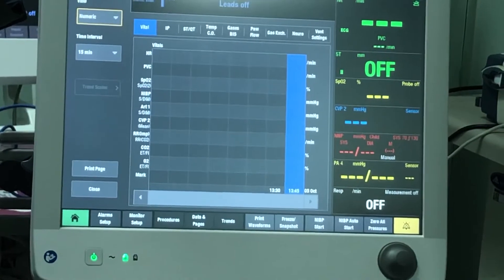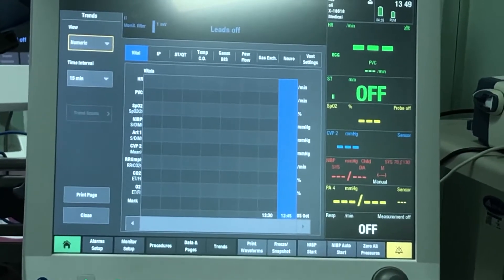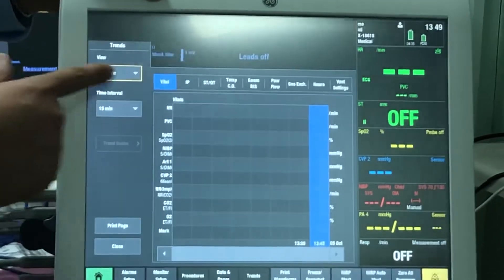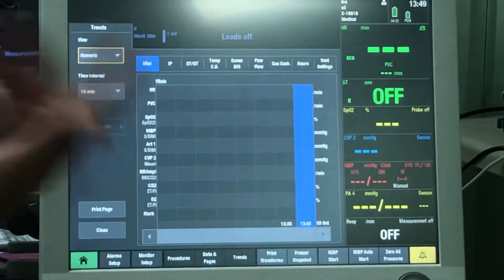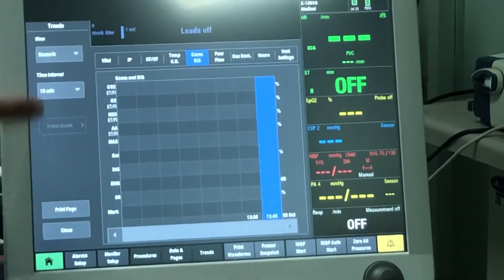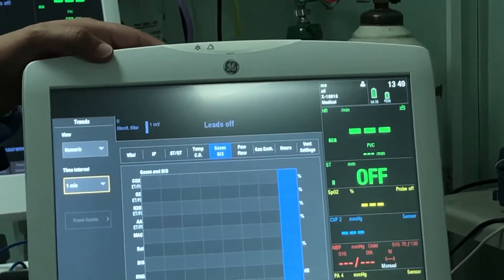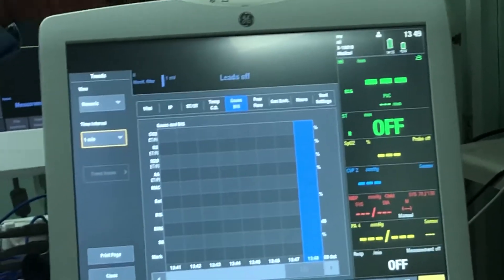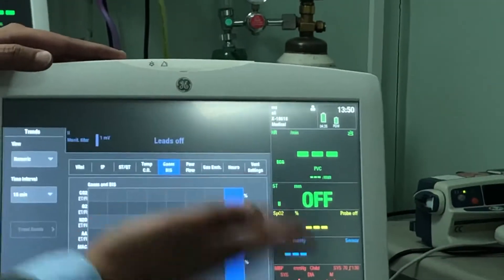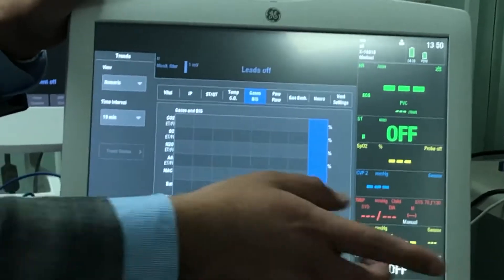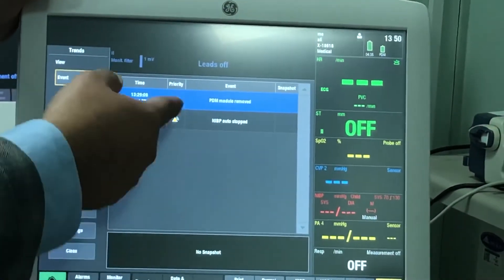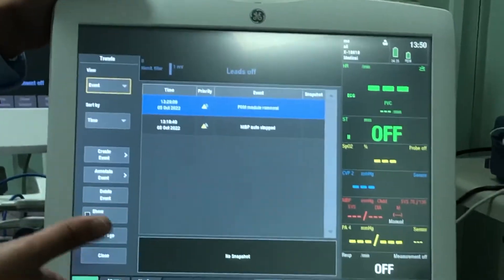For trends, all patient information is stored in the monitor for the past 72 hours — three full days of vital signs, arrhythmias, events, and so on. You can view this as a graphic drawing or as numeric values. The categories include vital signs, invasive lines, ST/QT, temperature, cardiac output, gases, and more. You can view minute-by-minute data for the past 72 hours, or set it to every 15 minutes or every hour. You can scroll through the data, and the numeric view is probably the one you'll use most.